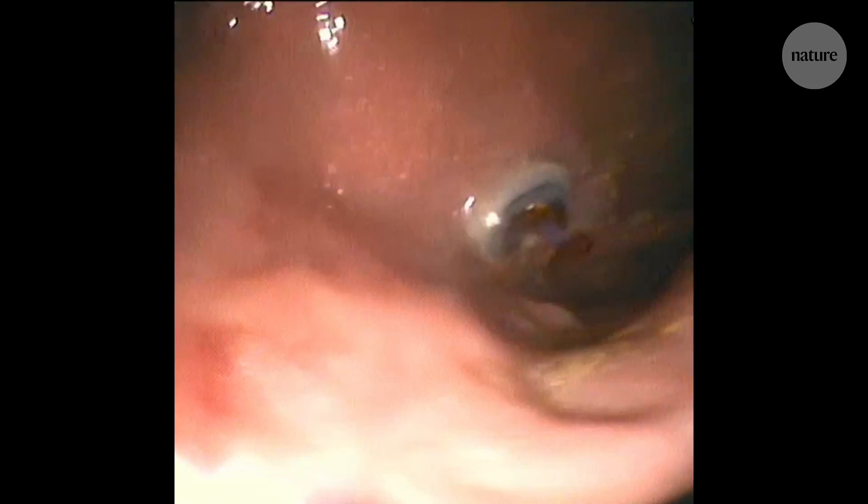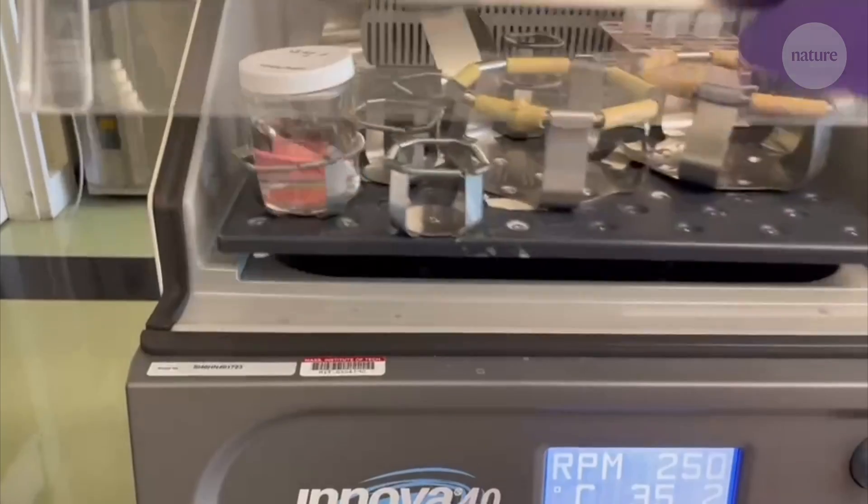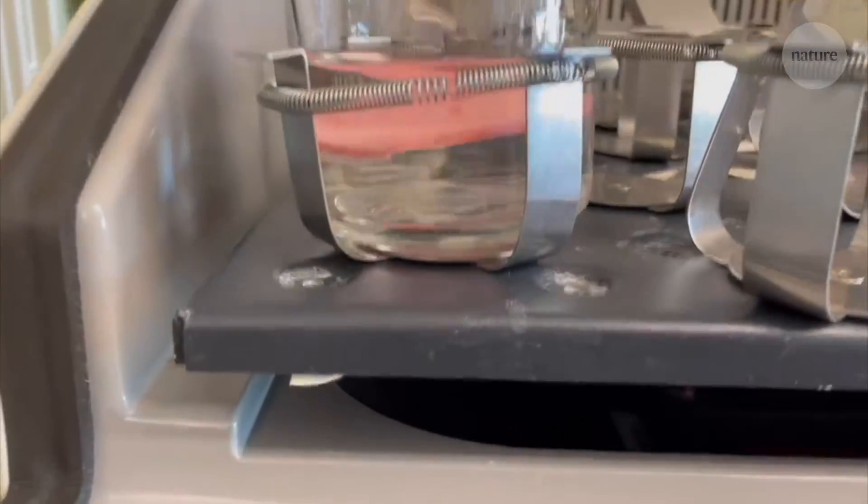In settings where there are few healthcare providers, we may have one opportunity to provide someone with a full course of treatment. Having the ability to dose a patient and ensure they receive the full course of treatment really helps maximize that person's health. There are other applications as well — a sensor for monitoring reflux, for example, or a way to deliver vaccines.